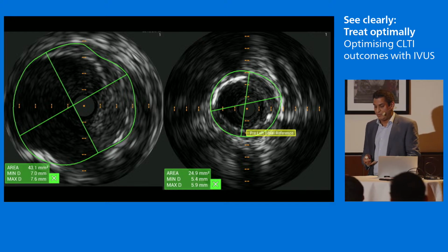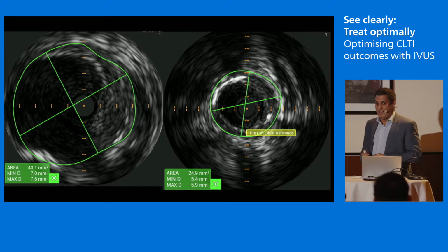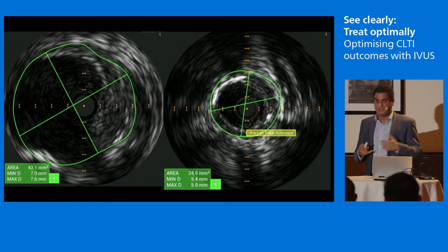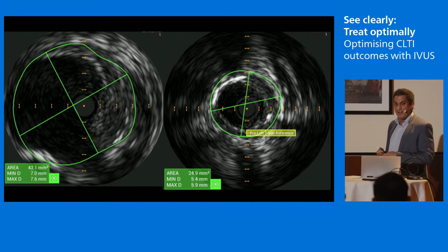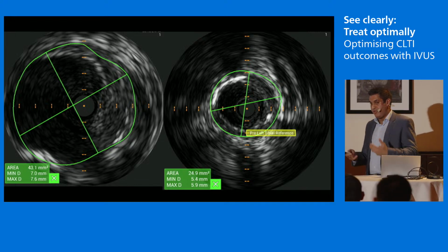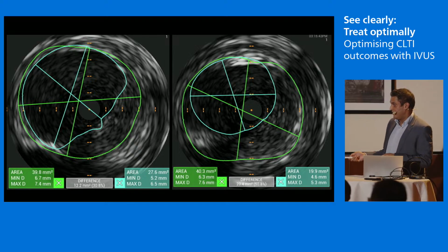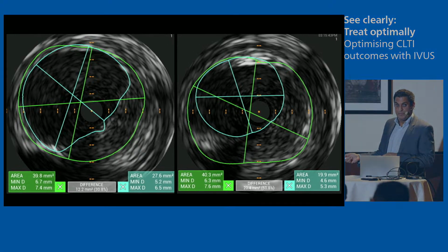So sometimes what we have noticed recently is that the tibial vessels are a lot bigger than what we're conventionally used to. We're used to 2, 3, at most 3.5 millimeter balloons, but certainly at St Thomas's we're going 3, 4, and even bigger at the anterior tibial artery origins. So here's me measuring that P2 lesion.